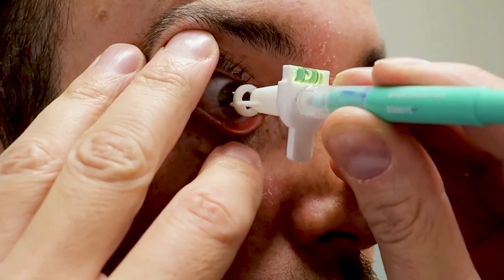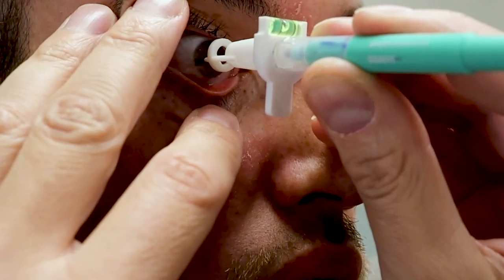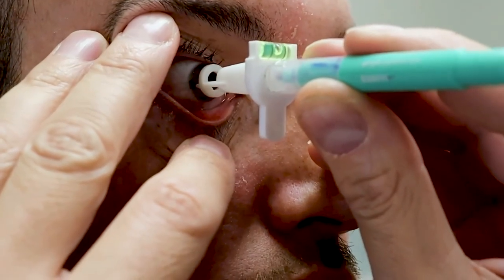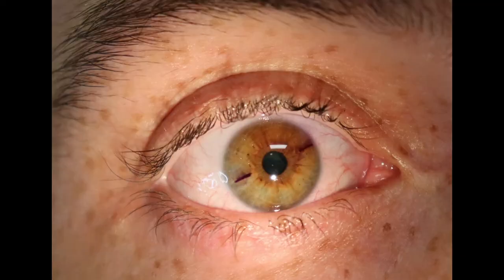Once you've centered the device on the center of the cornea, you center the bubble on the device and then just slowly bring the device forward until you apply your marks and then remove from the device. You've got nice centered, easy to see marks on the eye for when you place your toric lens.